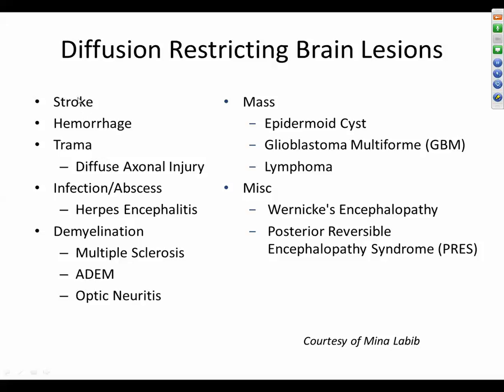Stroke is the most famous application of DWI, but there are other brain lesions that have restricted diffusion, like hemorrhage, trauma, infection, demyelinating disease, and cancer, and other issues. Mina has many exciting images, but due to the time constraint, I just skip them.